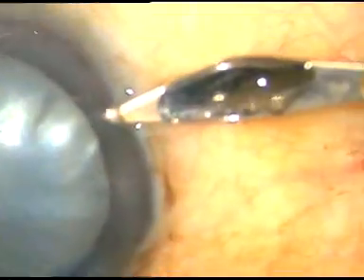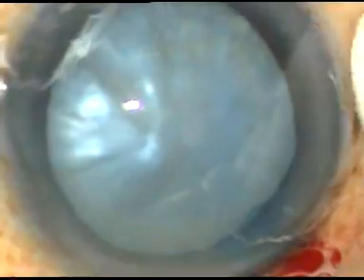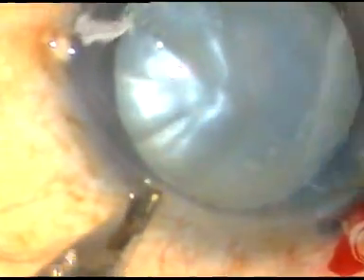Now two side ports are made. This is the side port on the right side of the main incision, and this is another one on the left side.